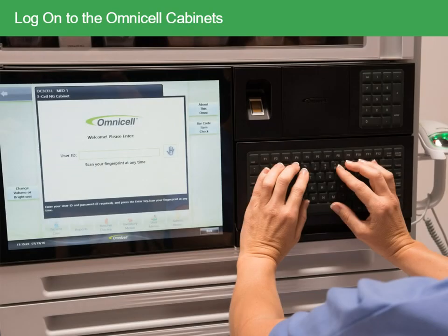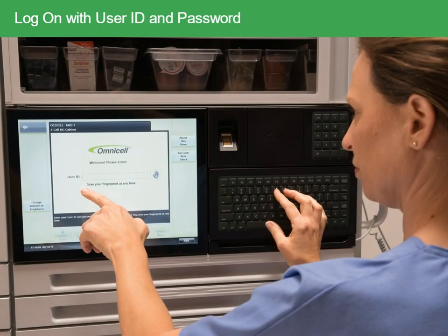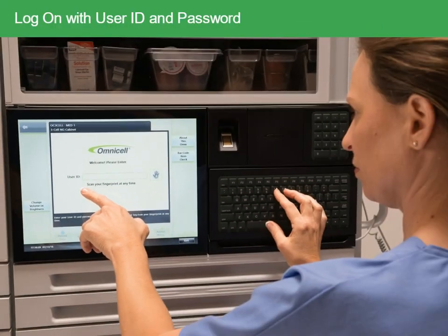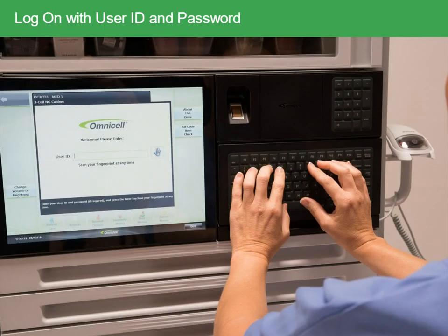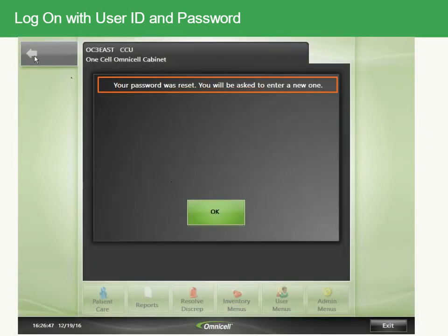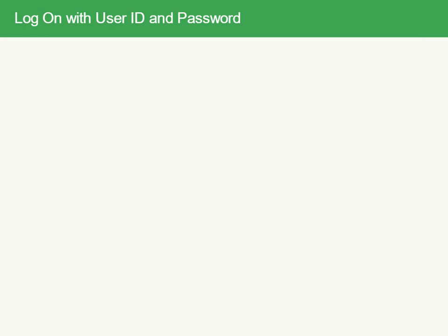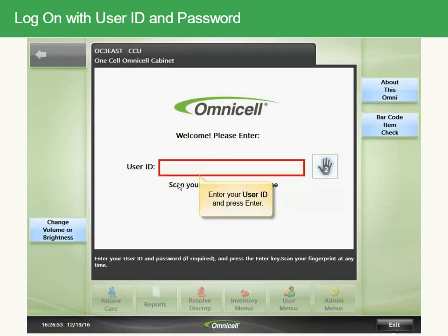You can log on to an OmniCell cabinet using your User ID and Password, or a fingerprint. Initially, you'll be required to log on with your User ID. Ask your system administrator to issue you a User ID, then attempt to access the Color Touch system by typing in your User ID. The system will prompt you to enter a new password. Your system administrator will add your User ID to the database so that you can begin using OmniCell cabinets.